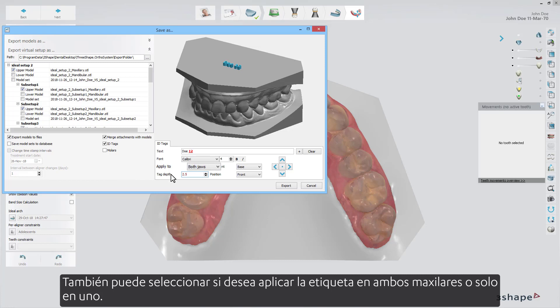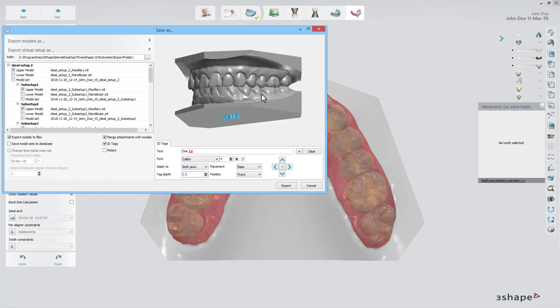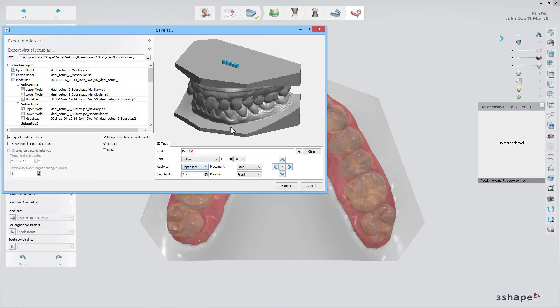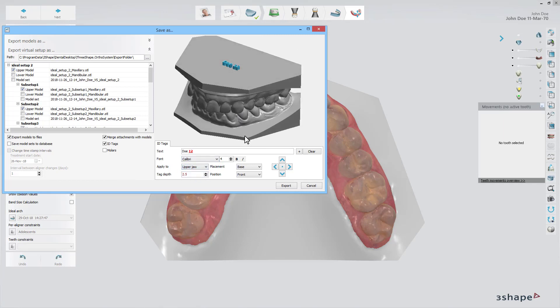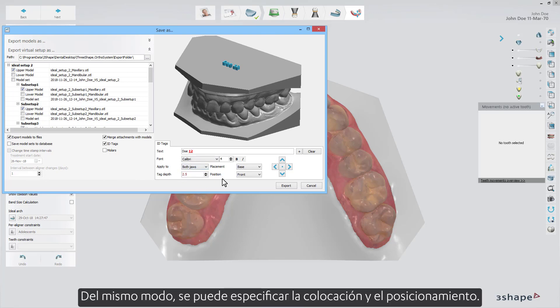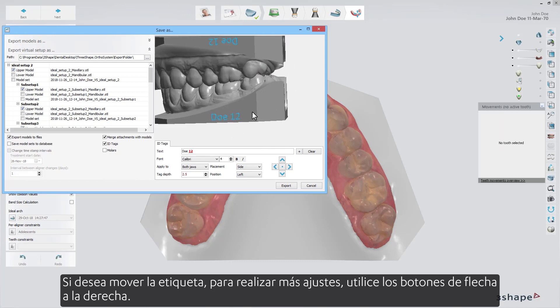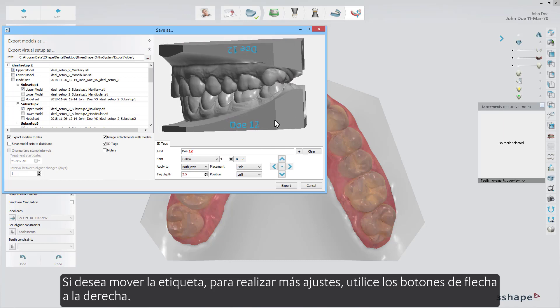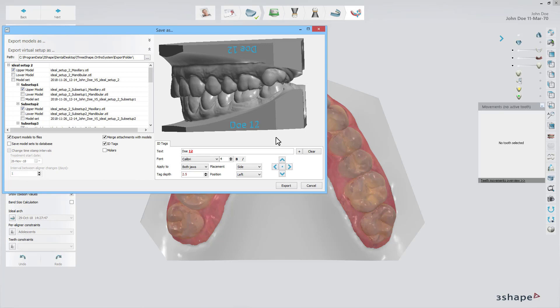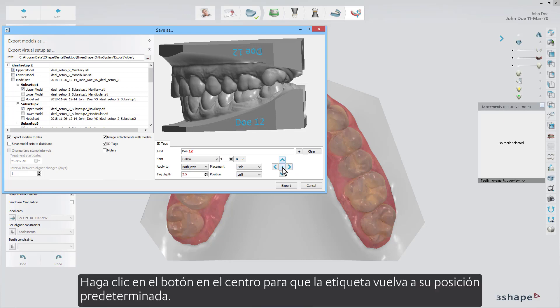You can also select whether to apply the tag on both jaws or just one. If you'd like to move the tag around for further adjustments, use the arrow buttons to the right. Click the button in the middle for the tag to come back to its default position.